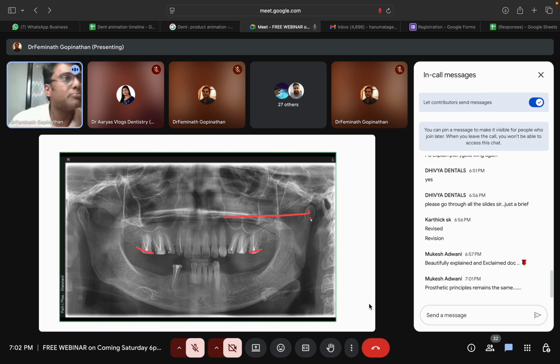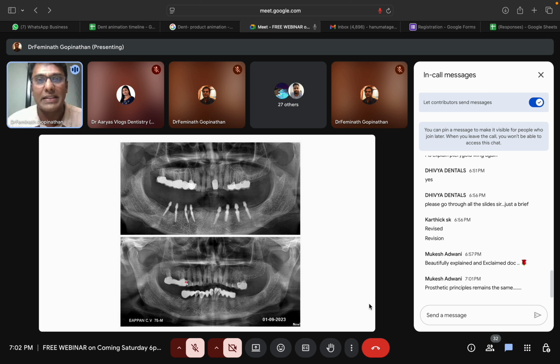Now see here what has happened. This was actually placed like this because of supraeruption. And I had corrected the whole plane in accordance with the ala-tragus line, that is the plane of occlusion, and then rehabilitated. Now as far as the target areas are concerned, the junction, as I have told you, of the medial and lateral pterygoid area, is a safe area. There are no blood vessels, all muscle attached from the lateral pterygoid plate.